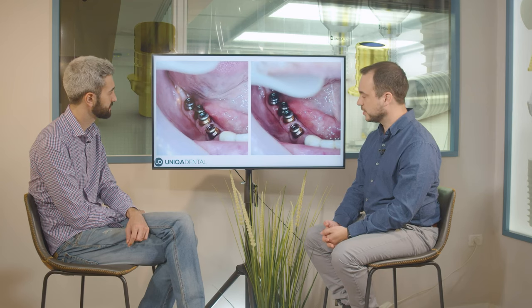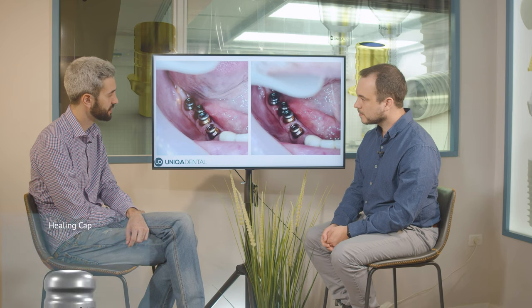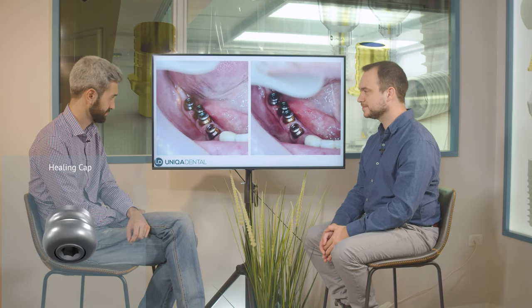We placed multi-units and on top of the multi-units we placed healing caps — for one week. For a week is enough; it's more than enough.